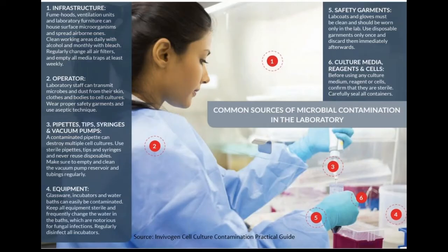Now let's look into the most common sources of microbial contamination in the lab. The first is infrastructure, meaning where you are doing your cell culture work. You have to make sure your fume hoods are well ventilated and the areas you are working in are clean.